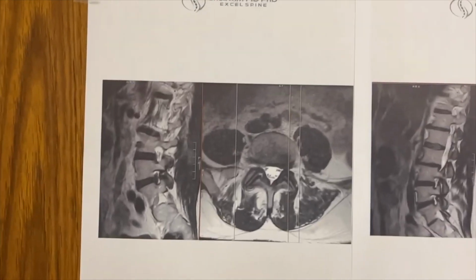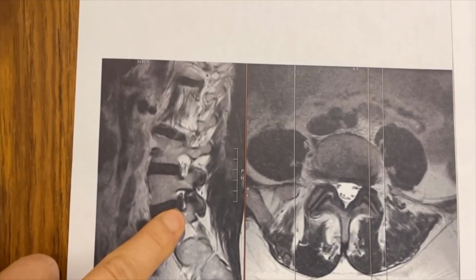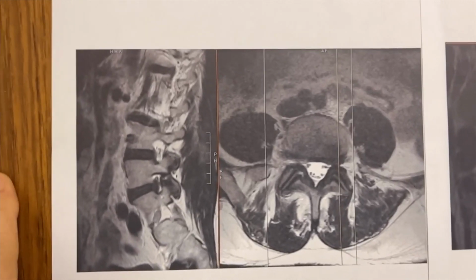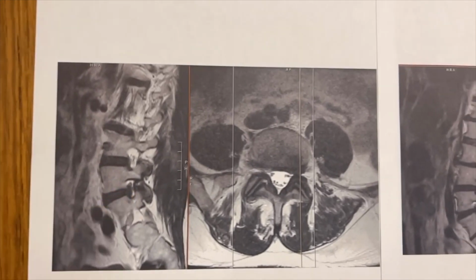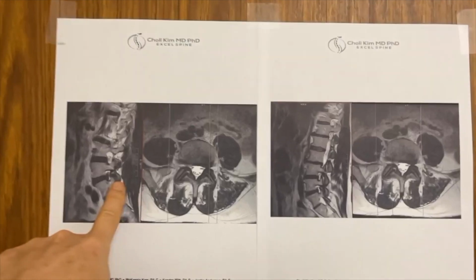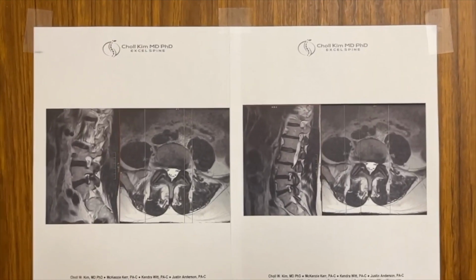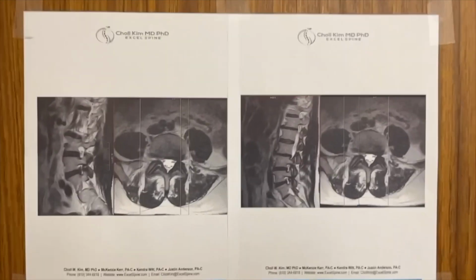If you look really closely, at first it doesn't look so bad, but if you look at the parasagittal images where the exiting nerve root comes out and a part of the nerve called the DRG, the dorsal root ganglion, it is like the most sensitive structure of the nerve. That's where that is, and if you have a disc bulge there and it touches the nerve, ouchie, it is really painful. We did a targeted transforaminal injection with both an anesthetic and a steroid, and the anesthetic provided 50% relief of her back and left leg pain.